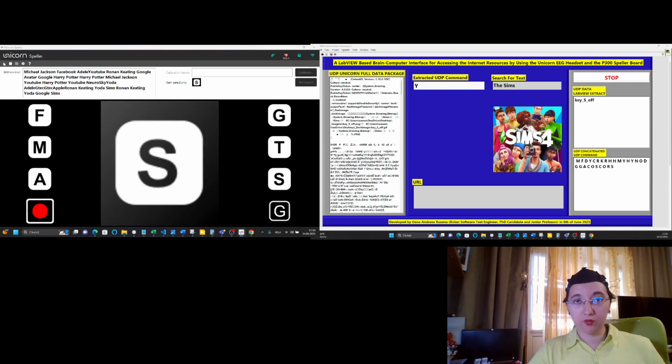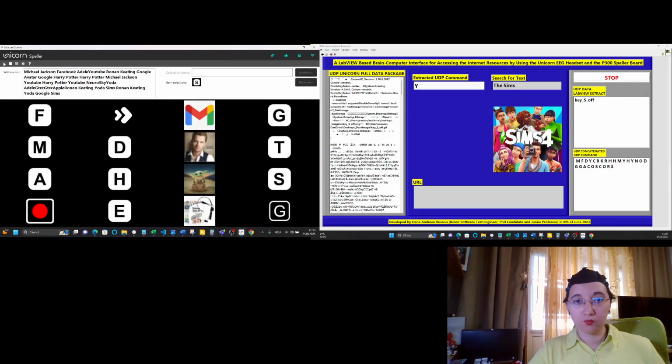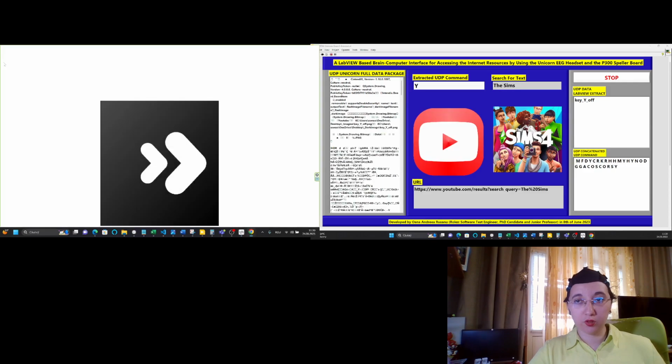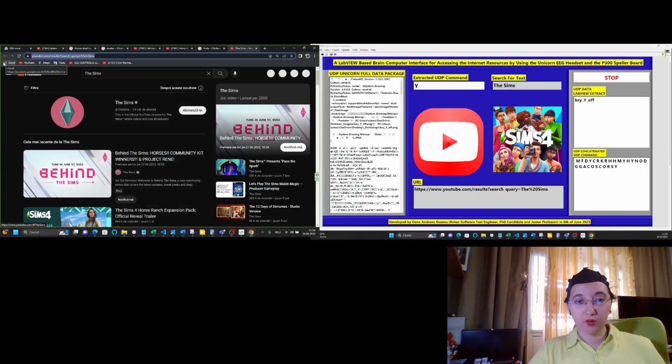Okay, Sims was correctly selected and now YouTube. Okay, perfect. So now the Sims text is searched in YouTube. You can see.